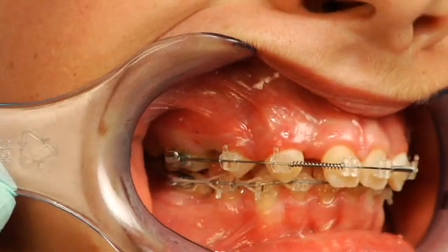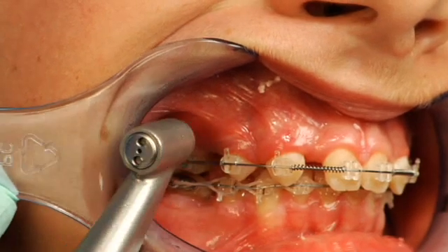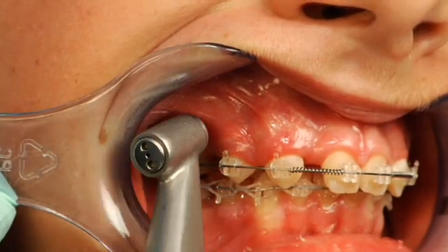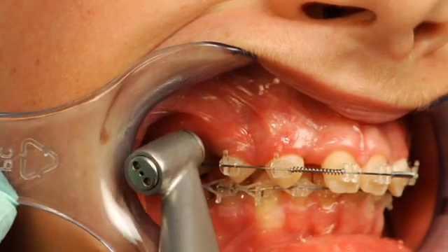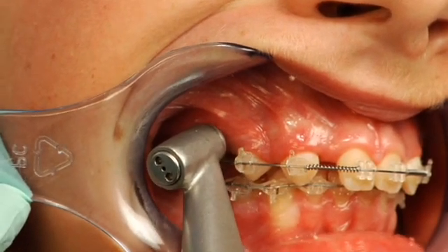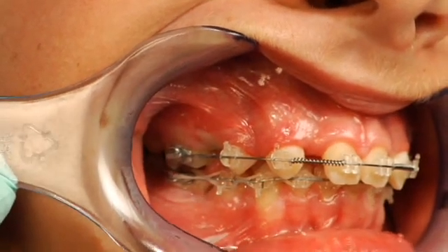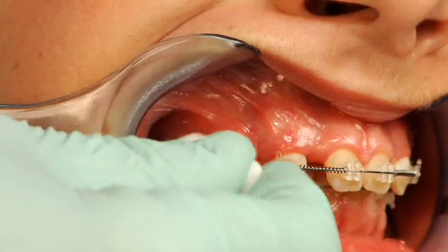We're going to follow up the topical anesthetic with 0.15 cc's of lidocaine using the SyraJet. It's placed flush against the tissue, and the local anesthetic solution is expressed under pressure into the tissue.